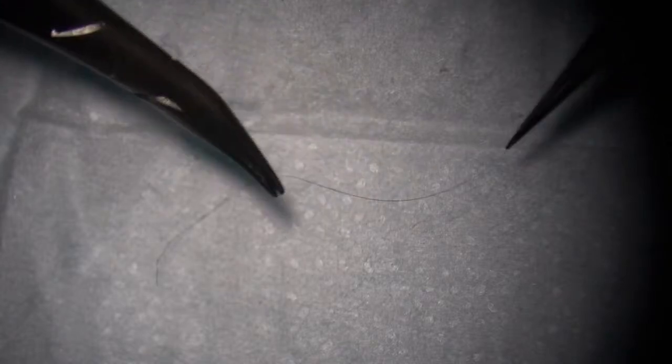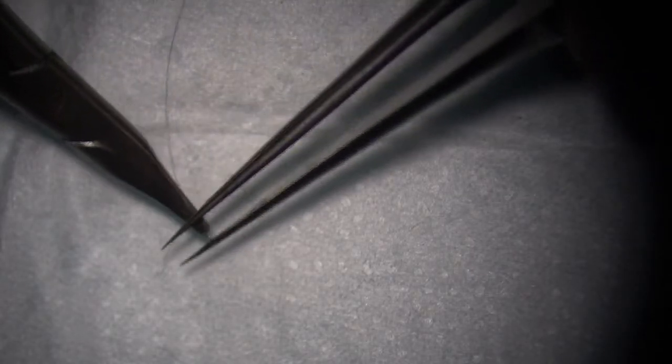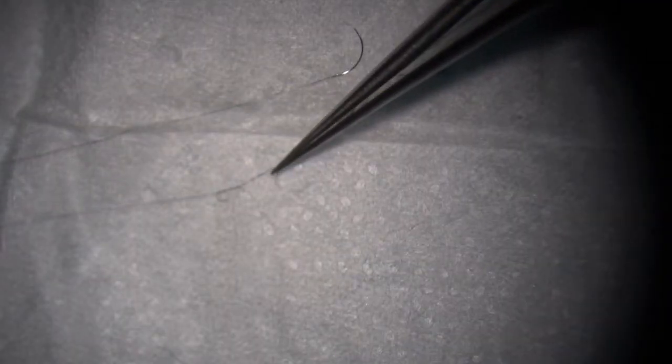Now here, there are two ways. One way is we pick up the suture directly with our needle holder and then go tie knots. And this way we have to close our instrument for the first knot. For the first knot, we really don't want to close our instrument. So at the beginning, we pull the suture out, bring it back in front of us and catch the suture with the needle holder. This way the first knot is very convenient. We don't need to close the instrument and tie a square knot. This is the way we can start.